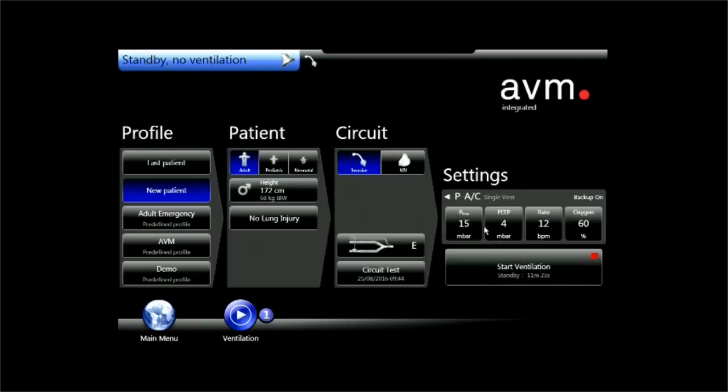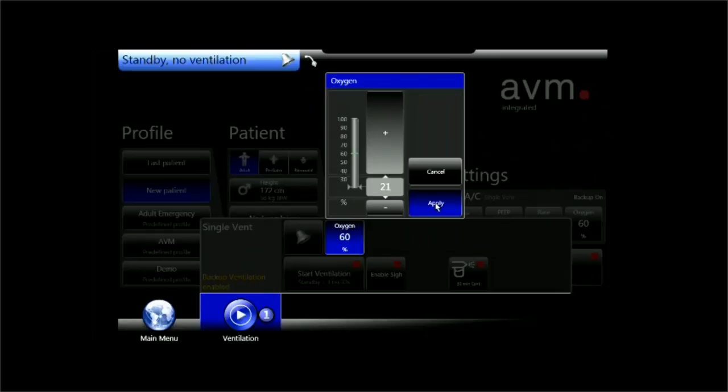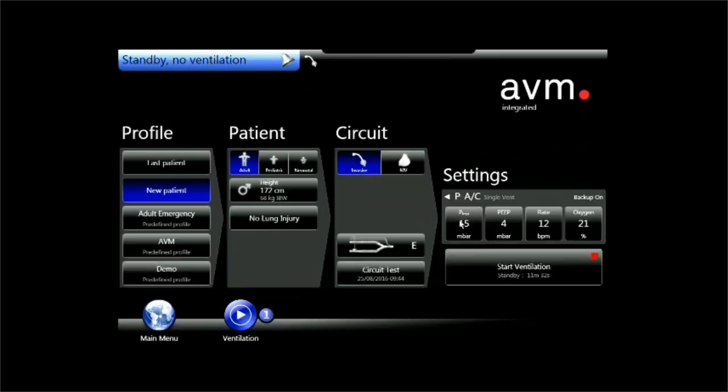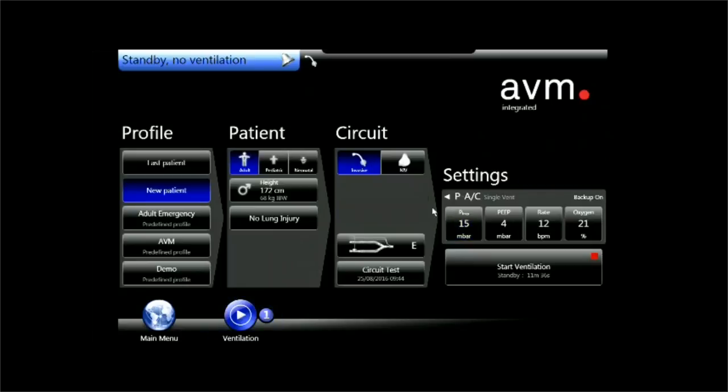So by hitting OK here, I receive ventilation settings and I get preliminary alarm settings, so I cannot forget to set my alarms. I just turn down the oxygen and I am happy with that and start ventilation.